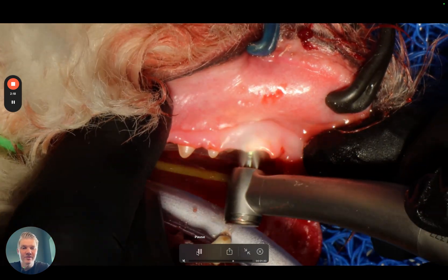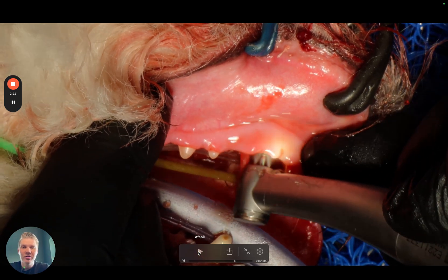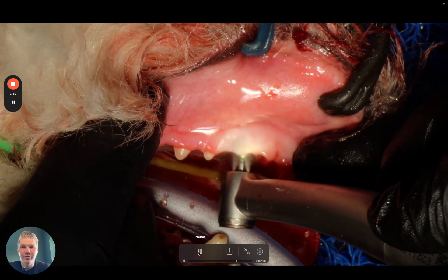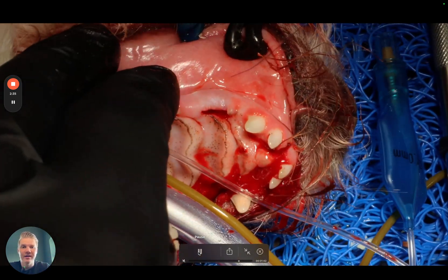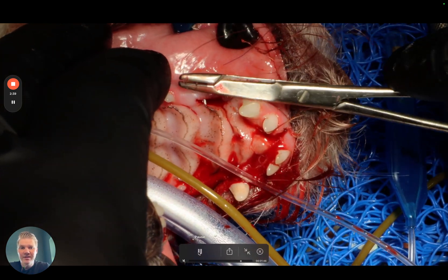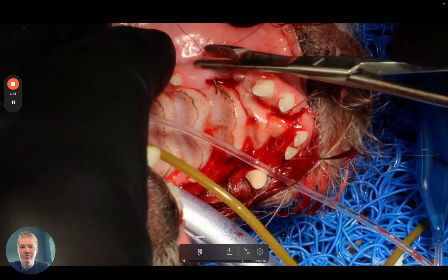The next step — because there was a chronic pocket on the inside, on the palatal side — I want to reduce and get rid of any epithelial layer that will interfere with healing. So I use my diamond football burr to walk around the inside of the flap, palatal side, buccal side, and debride some of that epithelium. You can see the elbows here; it is quite easy to close the gingiva just with a few sutures.